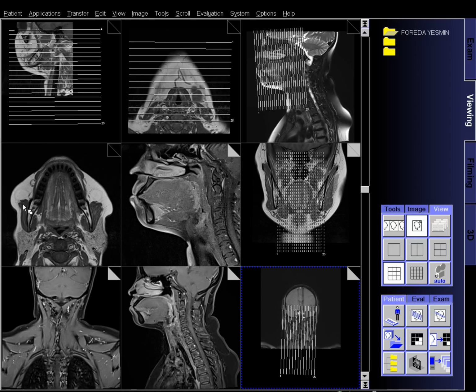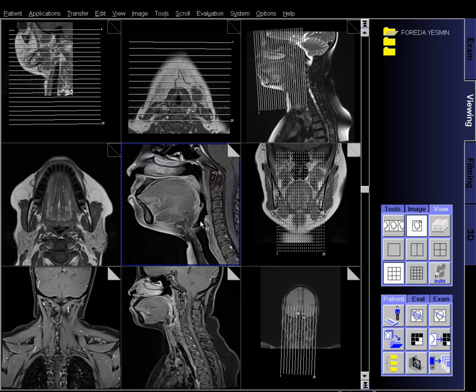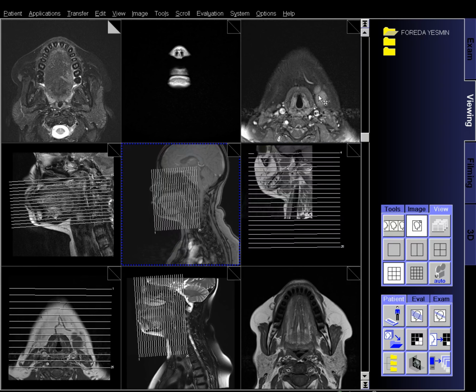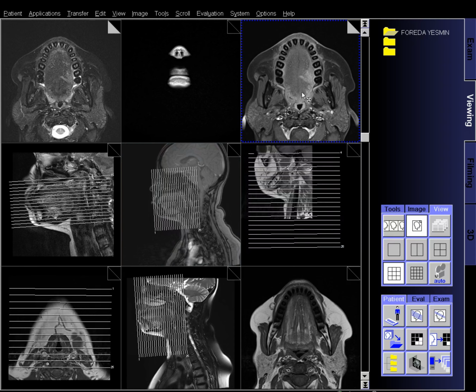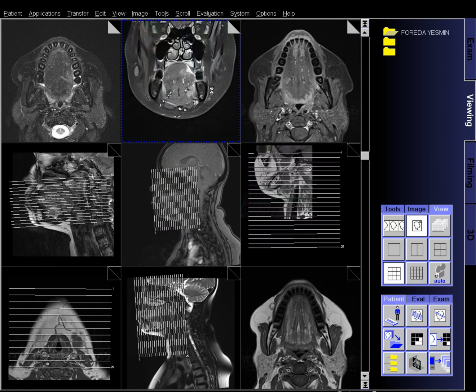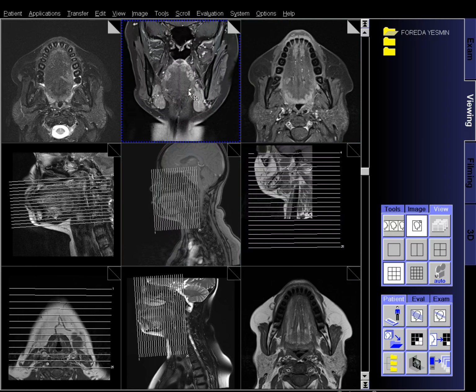Axial plane. This is the top to bottom section, viewing the face as if it's sliced horizontally. It shows the lower part of the eyes, the jaw, the roots of the teeth, and the deeper layers of the sinuses. This plane is especially useful for understanding the course of nerves and blood vessels in the facial region.